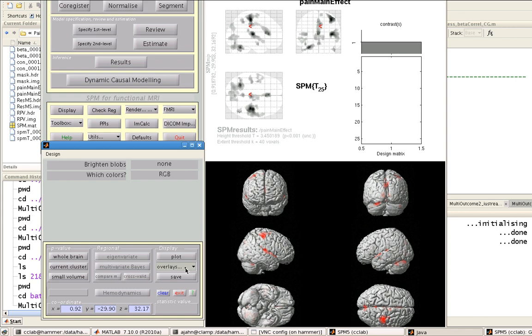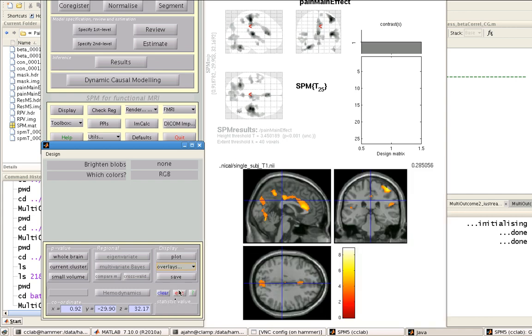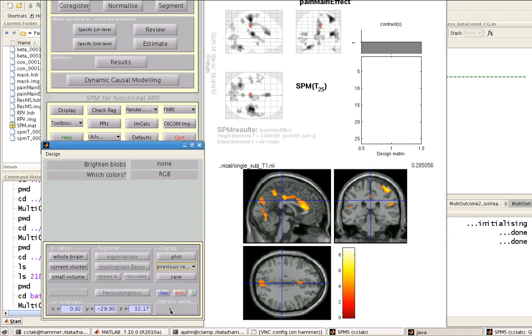So remember, if I want to toggle between the two, simply click on Overlays, and I can go to Previous Sections or Previous Rendering to switch between the two.